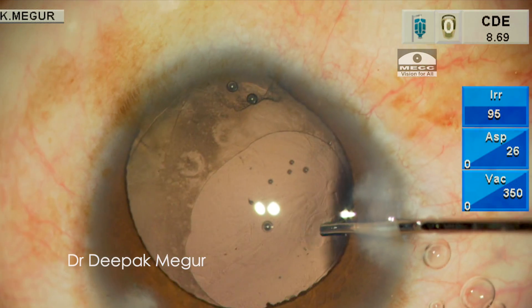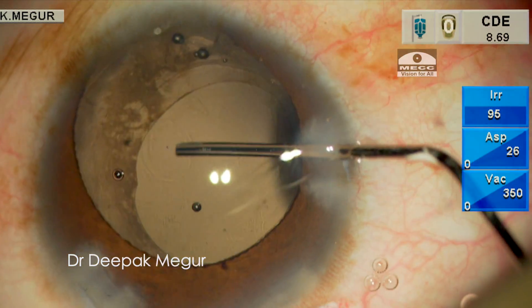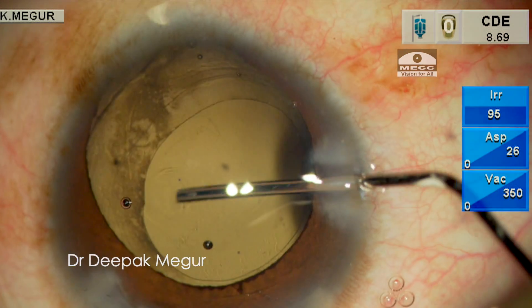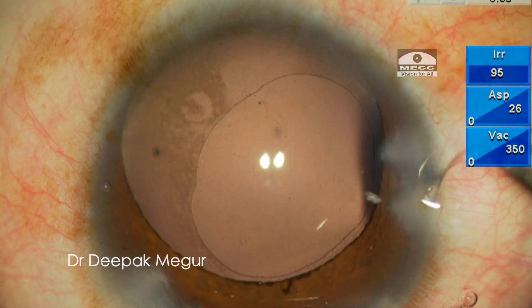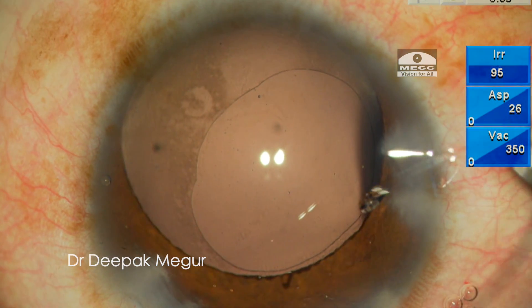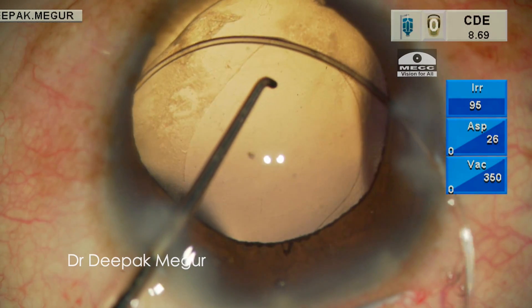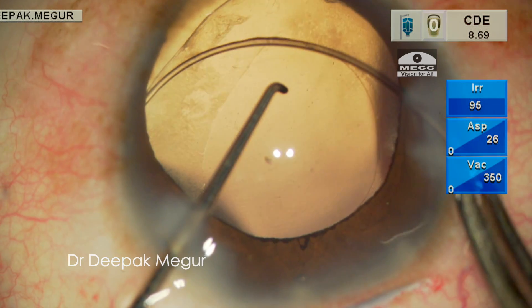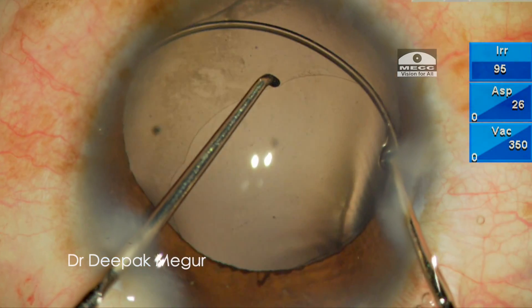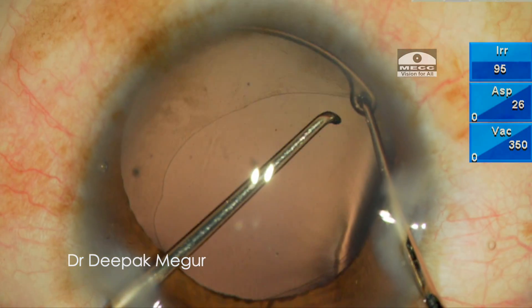Now is the time to insert the CTR into the bag. I fill the bag with 1.4% sodium hyaluronate. The CTR is then gently slipped under the rhexis margin and threaded so that it conforms itself against the equator of the bag. The CTR is maneuvered in such a way that the area of zonular dehiscence is well supported by the ring.